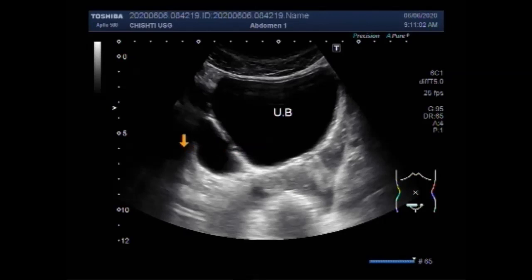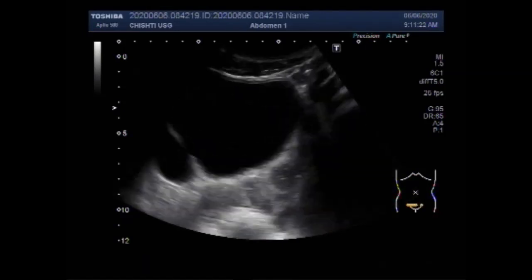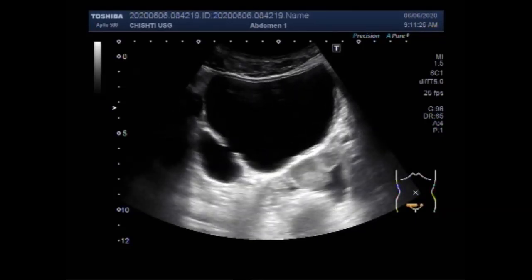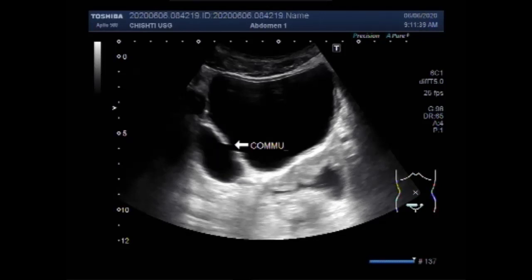Now you can see the diverticulum in the left lateral wall of the urinary bladder. This is the diverticulum and it measures about 42.6 mm by 24.1 mm. You can see the communication between the urinary bladder and the diverticulum, and there is a small amount of thick sludge seen in the urine present in the diverticulum.